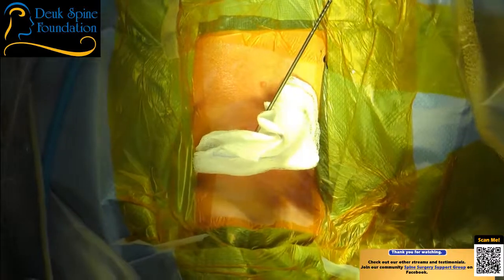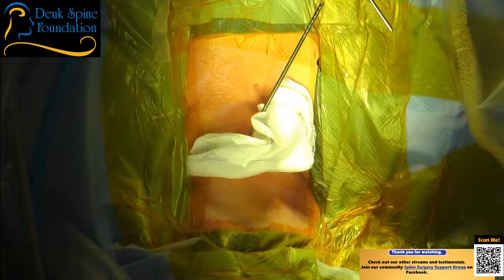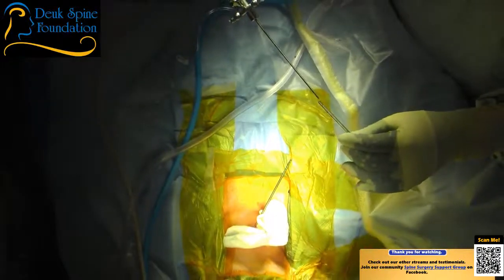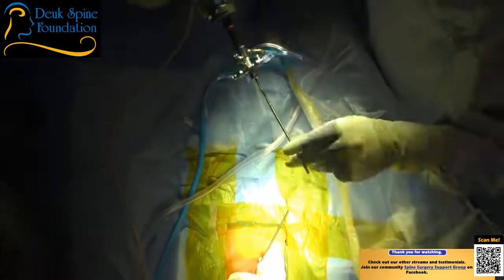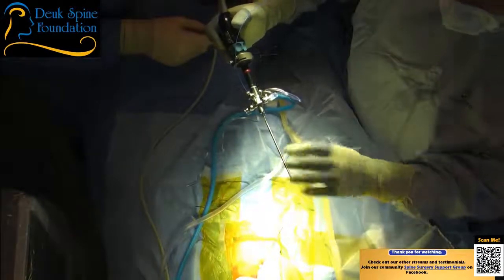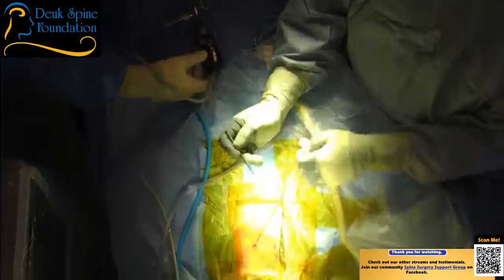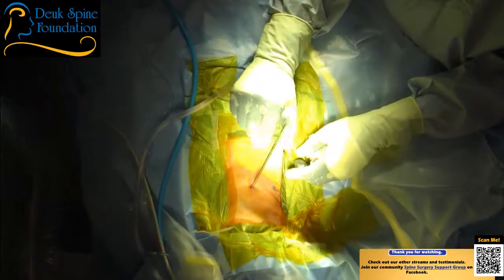We do endoscopic surgery. So for those of you who have never seen this before, this is the endoscope, the camera, the laser fiber, irrigation, light source. And we're going to place the endoscope right down the tubular retractor and out the bottom. Okay, and right at the bottom is where the herniation will be. All right, so the next step for me is I've got to bring this tube all the way down to the herniation. So the tip of the tube is where the herniation is.